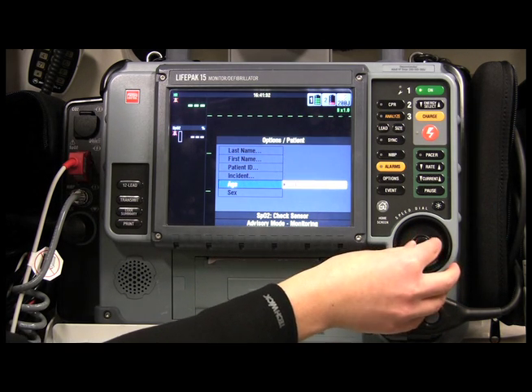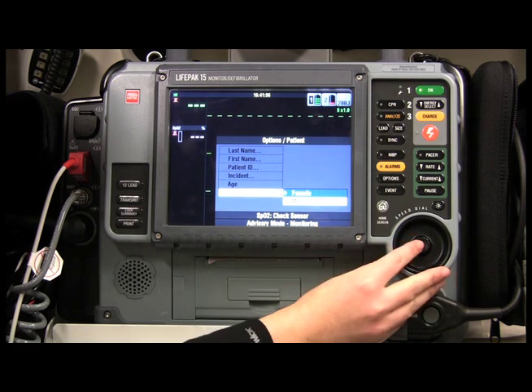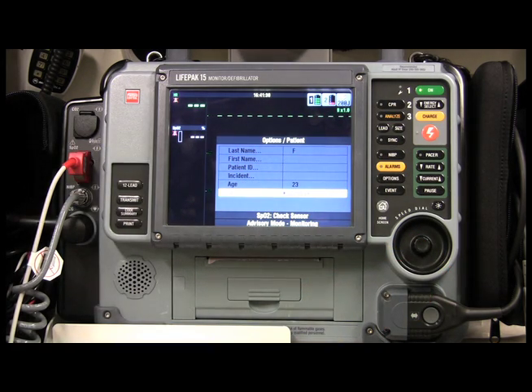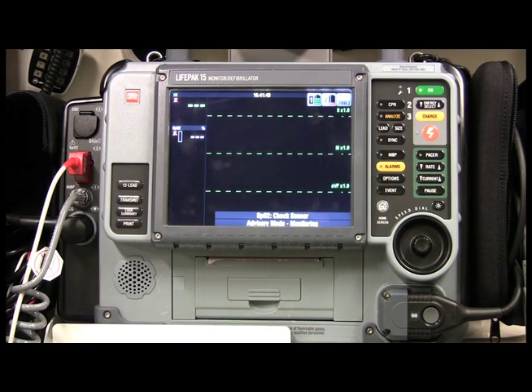You can fill in all the other fields the same way. Let's put in the age and the gender as well. Once I'm happy with my information, I just hit Home Screen and I'm back to the home screen.